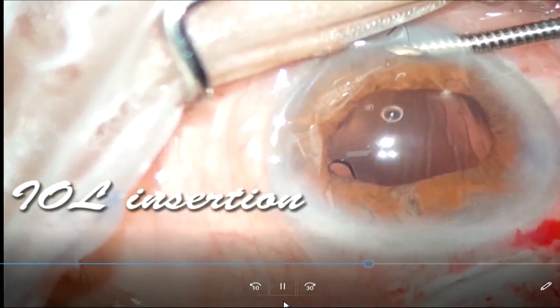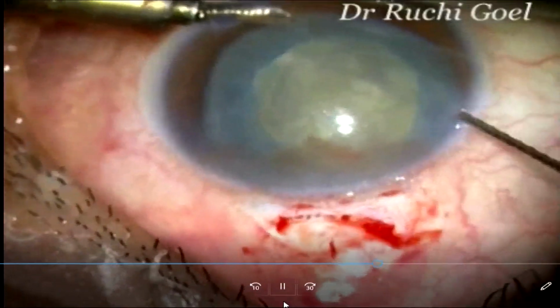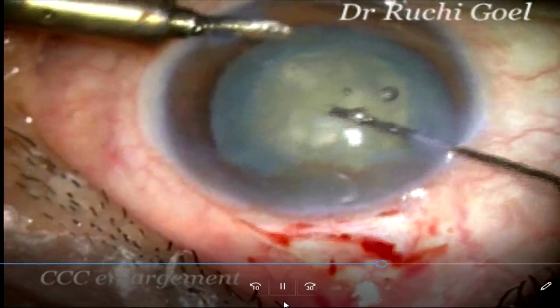You can put the IOL either under fluid or under visco. Nowadays I prefer to do it under fluid only with ACM on.